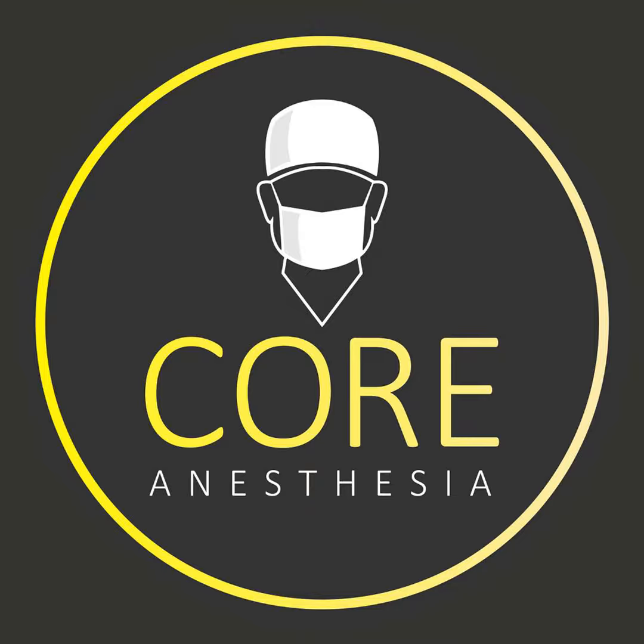You'll be doing that even with your MAC cases. You'll always be monitoring your end tidal CO2. If you're going to be intubating a patient, you'll be making sure that you check bilateral breath sounds. You're looking at chest rise and fall, and you're also verifying with end-tidal CO2 there as well. For your cardiac system, you're continually monitoring heart rate, and you're going to be monitoring the blood pressure, like we said, at least every 5 minutes.